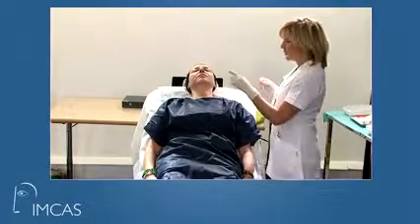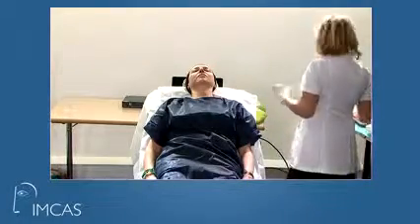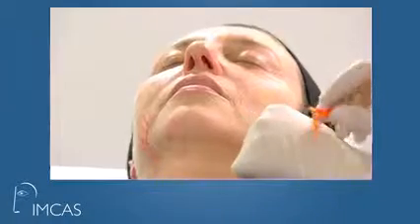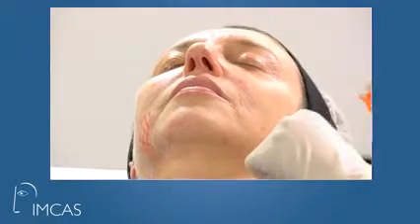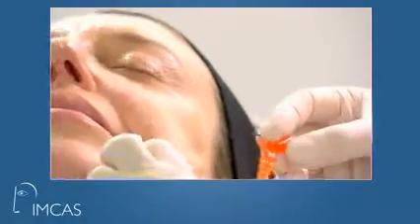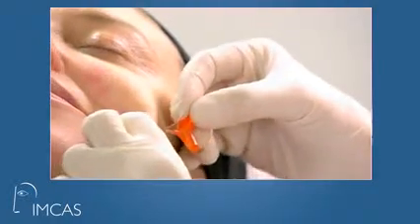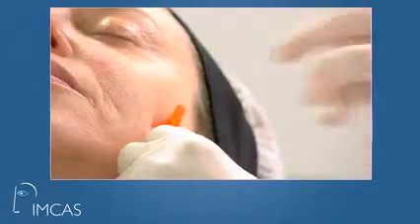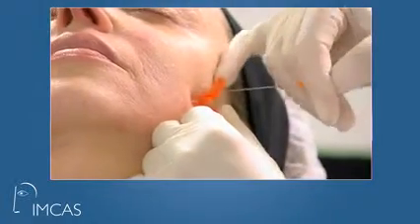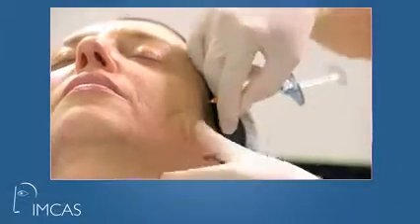I will inject the left side of the patient. So I use the Easy Guide, as Dr. Cassuto showed you before. The Easy Guide is very interesting because it's not necessary to use two movements to introduce the cannula.